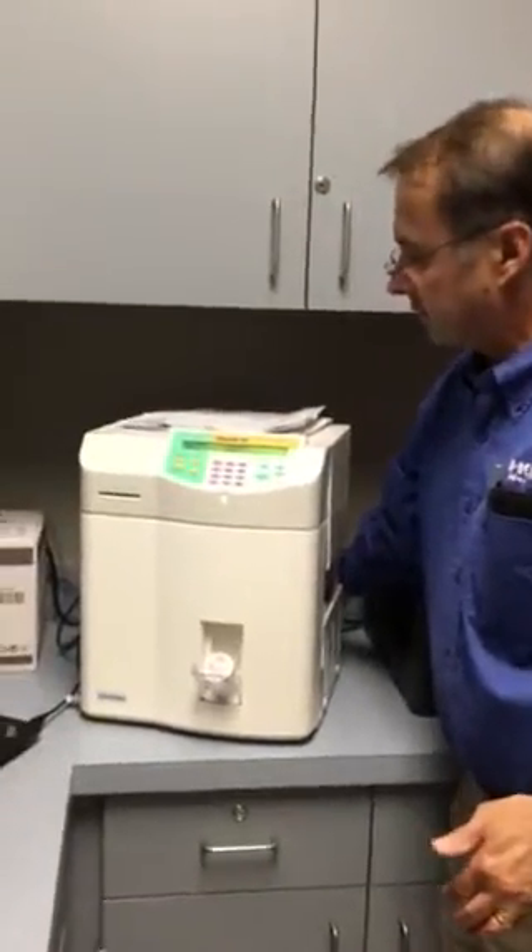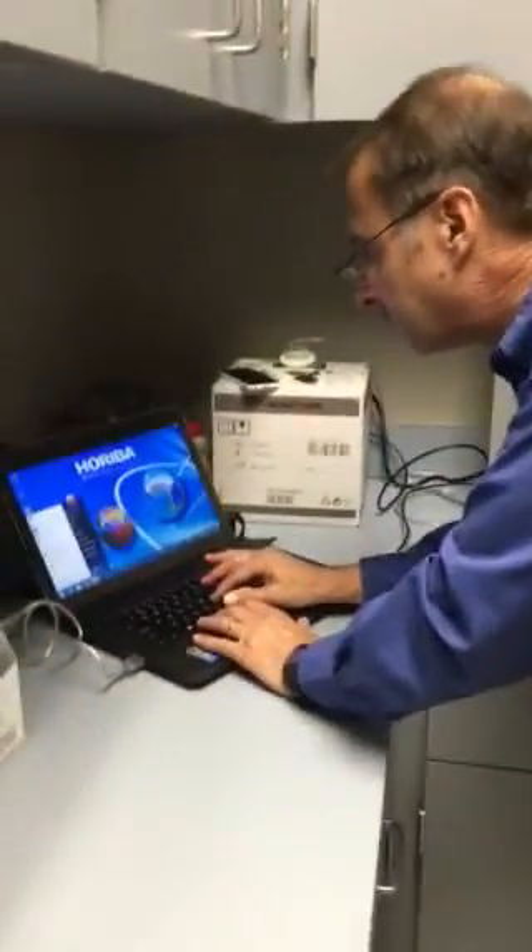Back here next to the power cord, there's an old toggle switch if you want to take a look. It's right next to the power cord. I'm just going to shut this down and bring everything up.